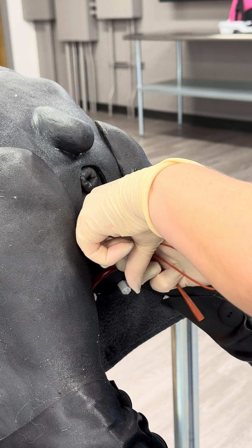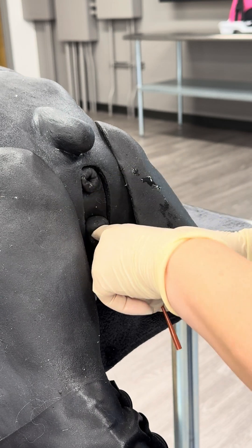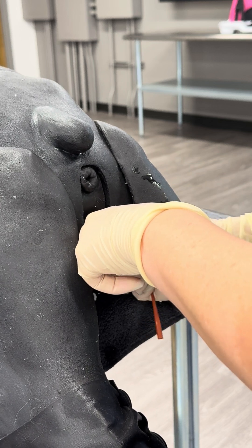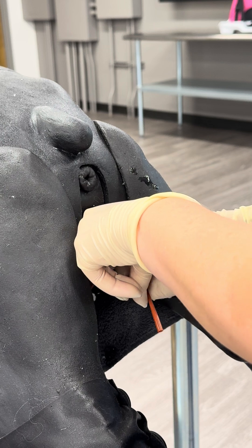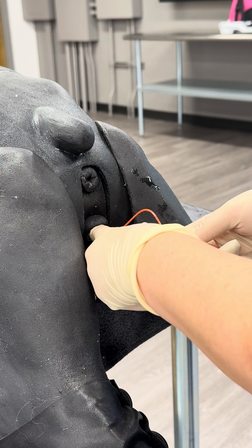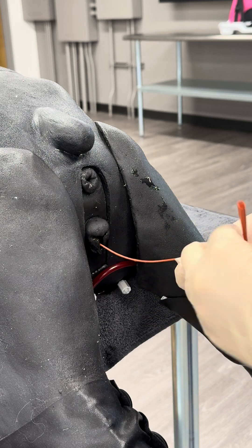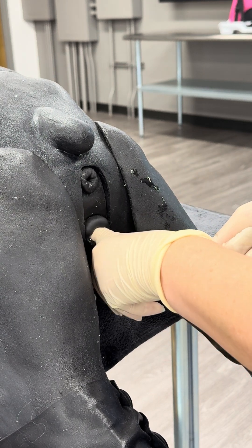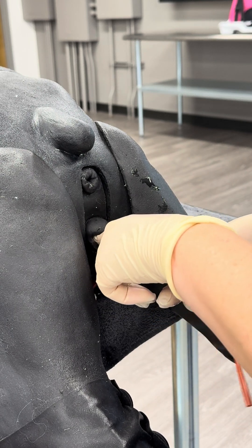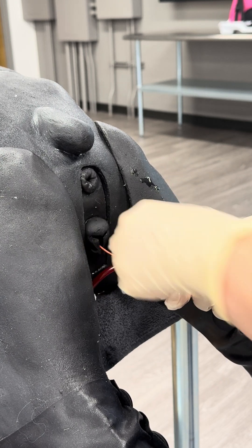I'm going to feed this catheter in gently. This is a pretty noxious procedure, so female dogs will require some sort of sedation. It's also nice to use sterile lidocaine gel to help numb the urethral tissue. I know that this catheter is in when I feel it disappearing underneath a piece of fleshy tissue. If the catheter is in the incorrect spot, I will be able to palpate it all the way to the vagina and potentially up to the cervix. I feel this catheter is going into the urethra because I can feel the piece of tissue on top of my catheter.